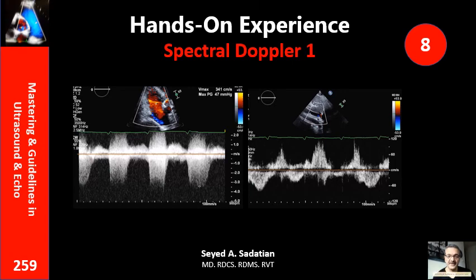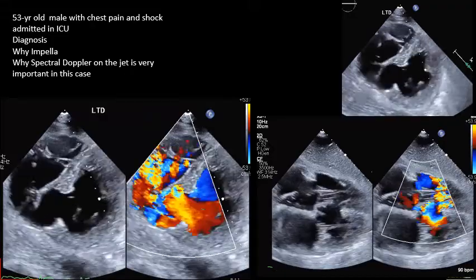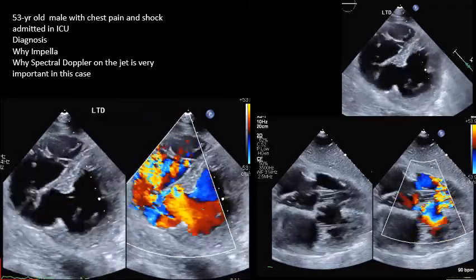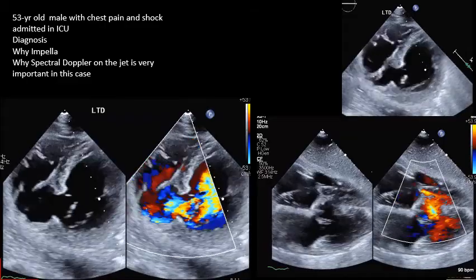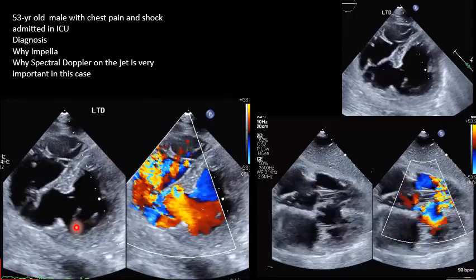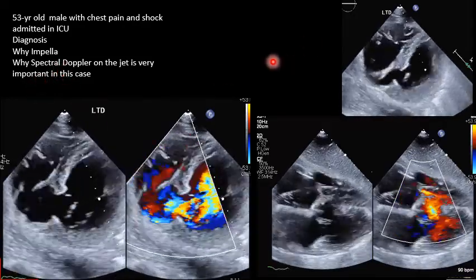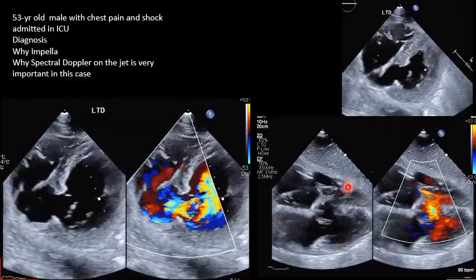Welcome to Mastering Guideline in Ultrasound and Echo. Here is hands-on experience number eight, the first part on spectral Doppler. We have a patient, 50 years old male, admitted with chest pain and shock — blood pressure below 90. They request a stat echo and you go and get these views. Based on this view, what is the diagnosis?